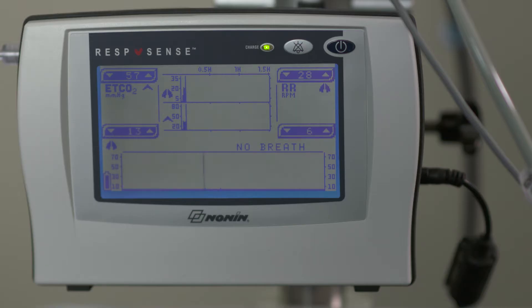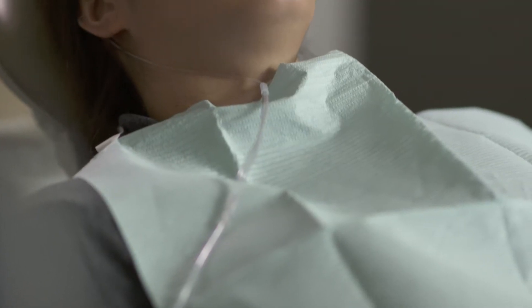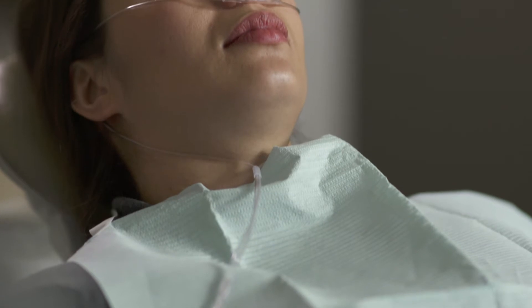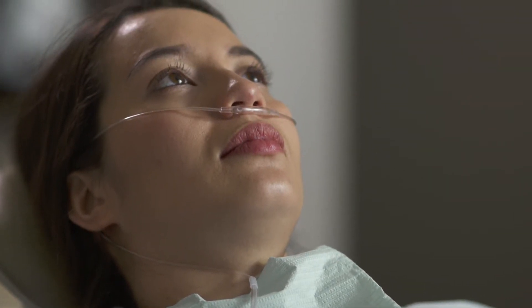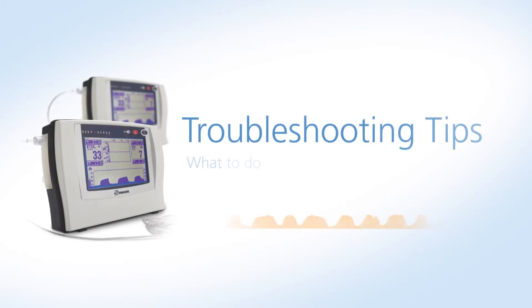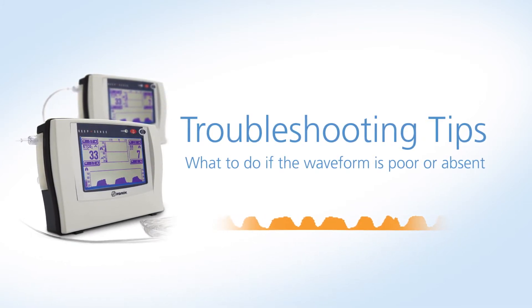The most common issues you may encounter with a side stream capnograph are no waveform accompanied by a no breath message, or a dampened waveform with a low reading. This indicates the CO2 from the patient is being diluted or the patient has stopped breathing. Here are some troubleshooting tips if the waveform is poor or absent.